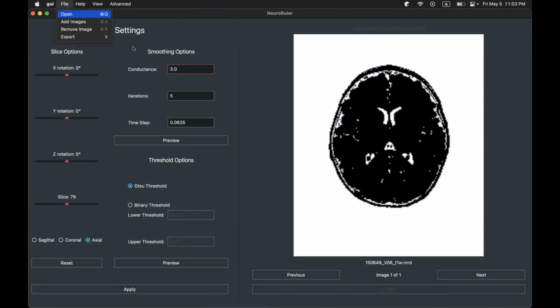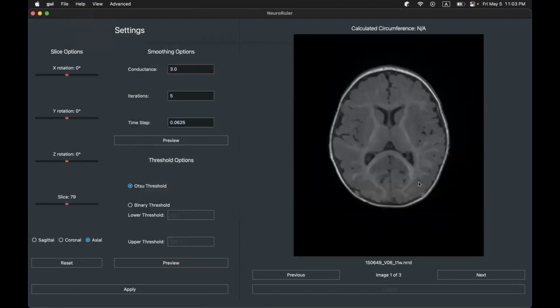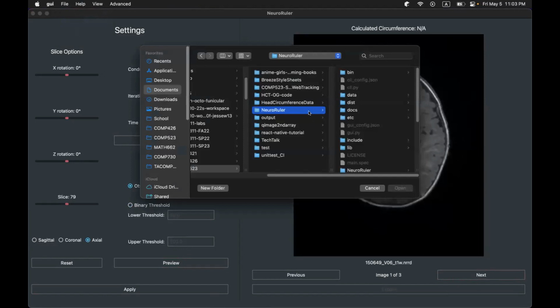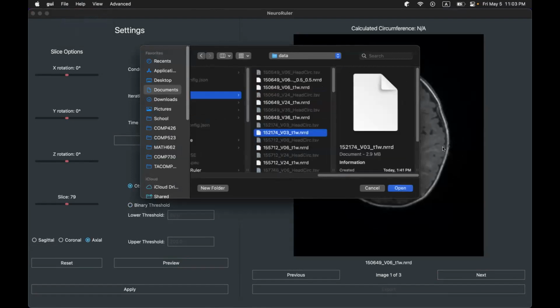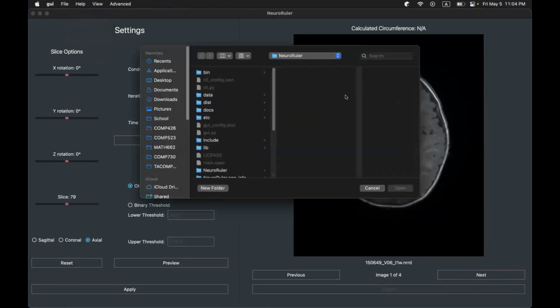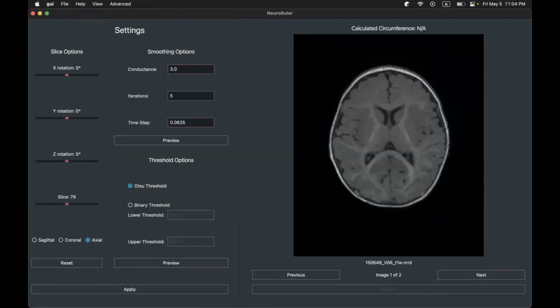We'll now go to multiple images. If I go to open and I do 3 images, you'll see I have 1, 2, 3, and it wraps around back to 1. Let's do also add image. The difference between open and add is add will just append to the list, open will overwrite it. So if I add this one, that's image number 4. If I open, now it would just be a list of length 2.